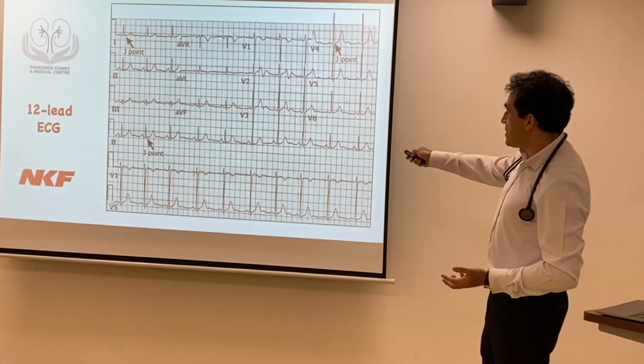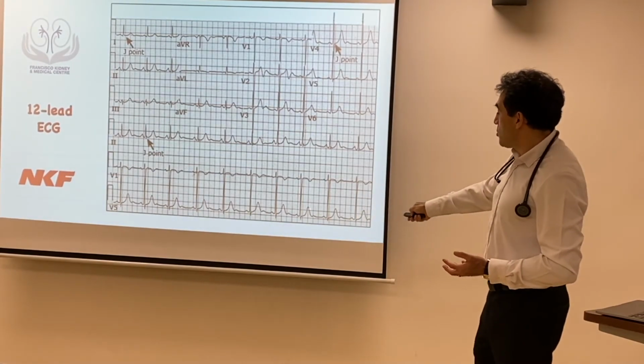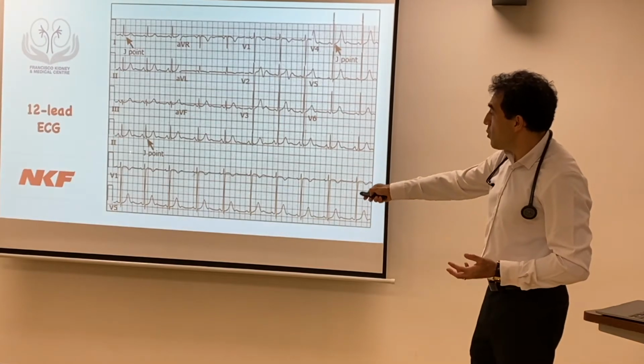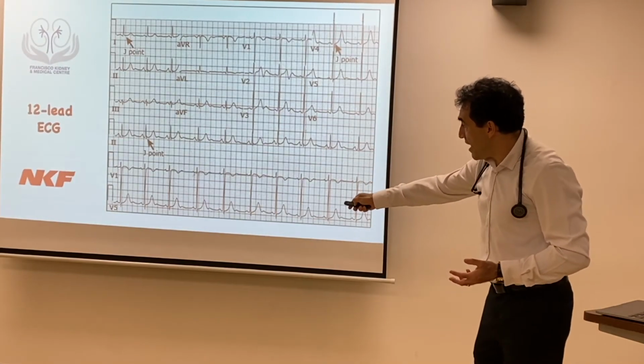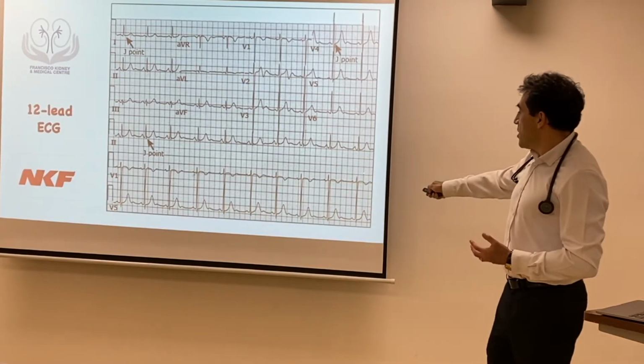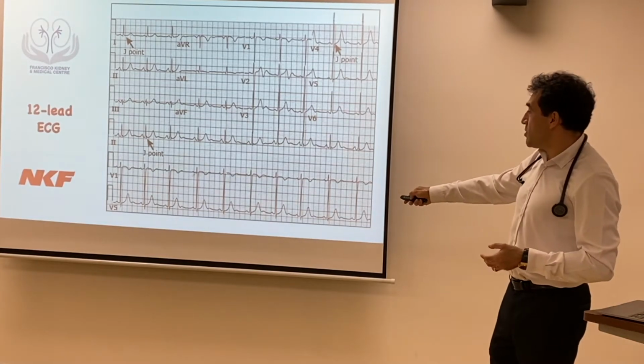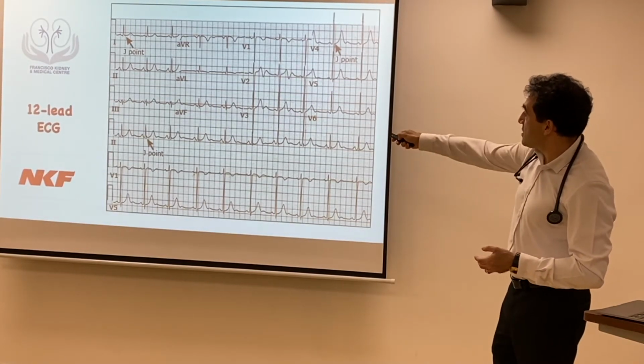This is an ECG. Many ECGs have 1 or 2 extra leads, but it's one of those leads, just an extra picture going through the whole strip so that you can detect rhythm problems and heart rate more simply. But these are the leads.